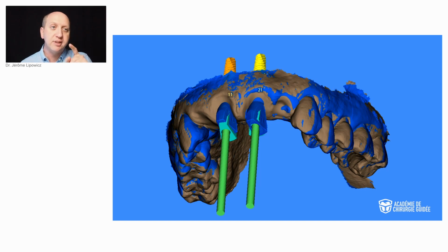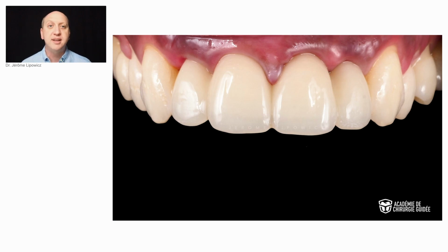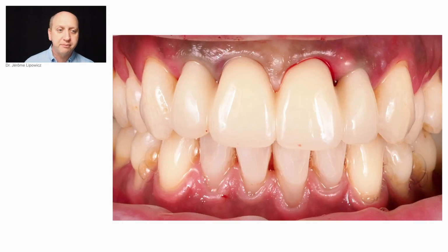This is the post-operative impression, and you can see when matching the virtual scan bodies with the real scan bodies that the implant number 11 has a little bit tilted forward. And here we placed very narrow diameter implants, very difficult to place because only 1 or 2 drills are necessary. You don't have any second chance. And thanks to guided surgery, we aimed correctly and we get an excellent stability. And also a nice outcome, a nice aesthetic and functional outcome just a few hours later.